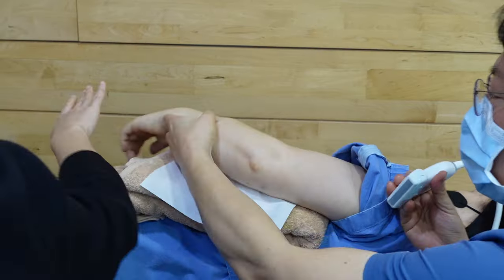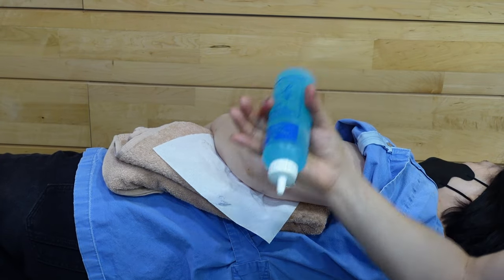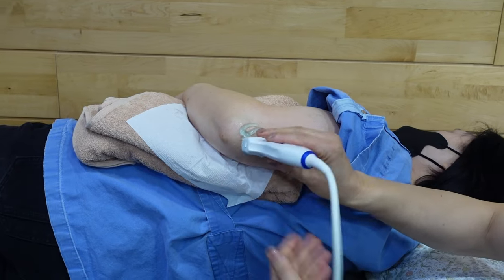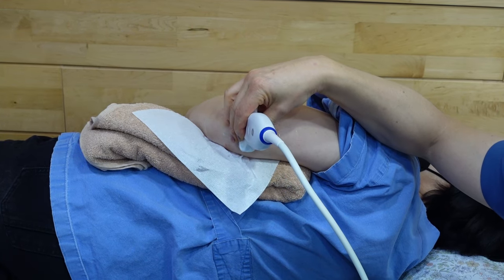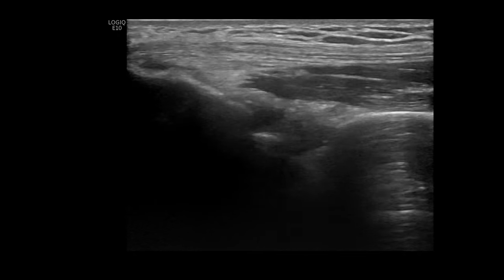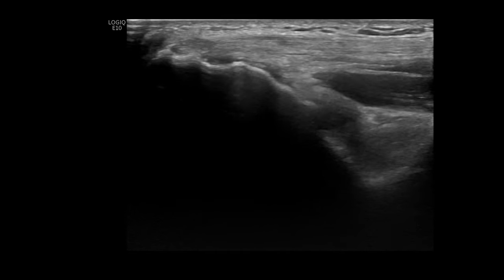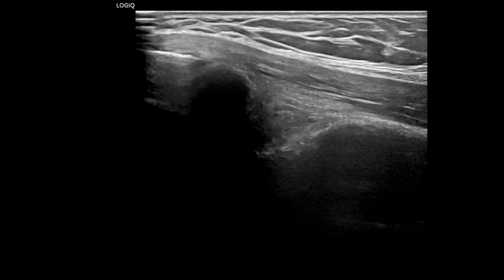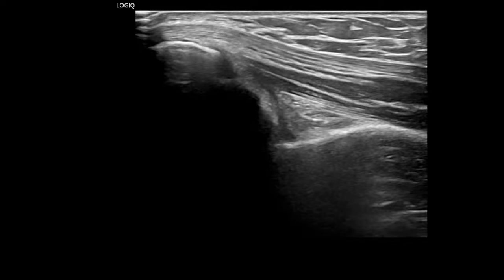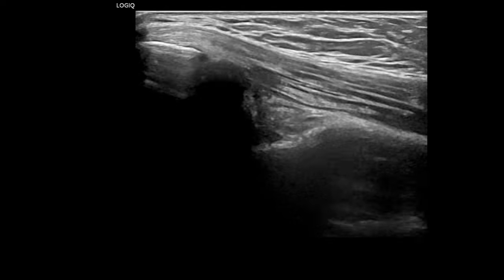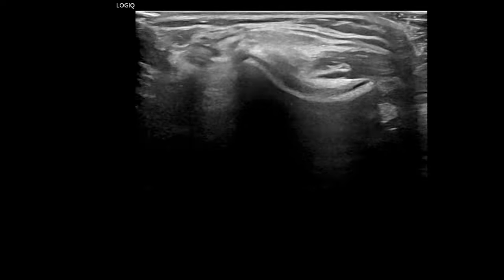For posterior evaluation, the posterior elbow is examined with the joint flexed at 90 degrees and the arm resting on the lateral chest wall in a lateral decubitus position. The olecranon fossa, triceps tendon, and olecranon process should be thoroughly evaluated using longitudinal and short axis planes. Particular attention is needed for the most distal portion of the triceps tendon right up to its insertion into the olecranon process. Beneath the triceps, both the olecranon fossa and the posterior olecranon recess are assessed. When evaluating the olecranon fossa and the superficial olecranon bursa, it is important to avoid applying excessive pressure with the transducer, as this may displace small bursal effusions.